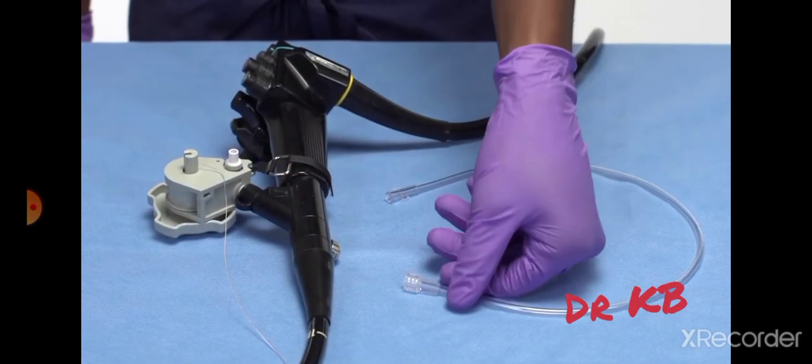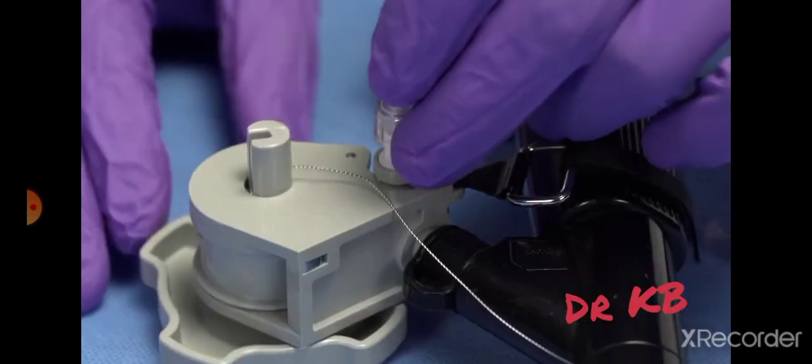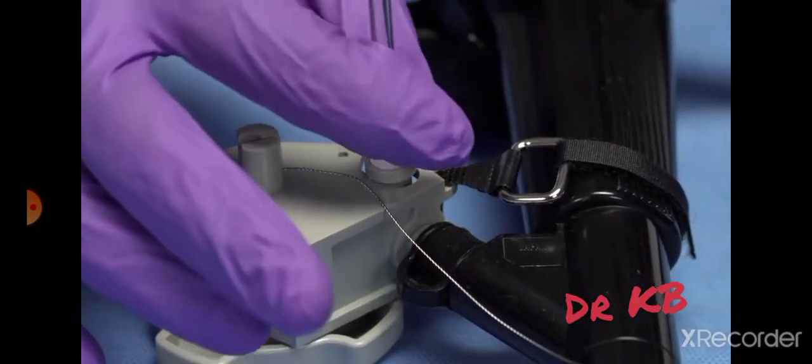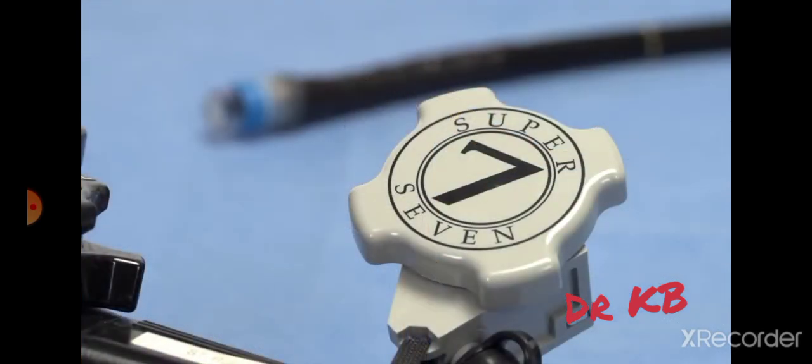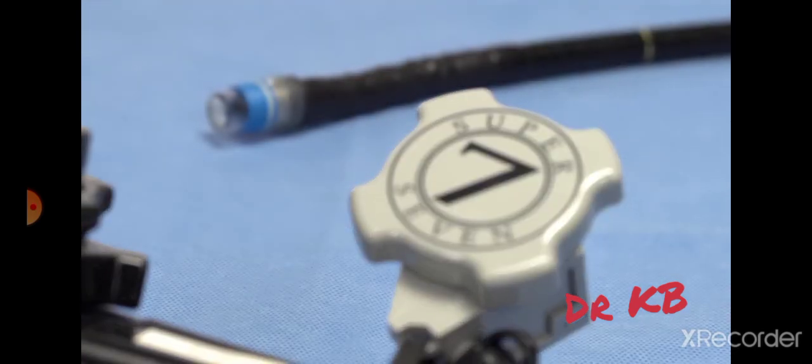For irrigation, attach a syringe or the irrigation tube provided to the luer fitting on the irrigation valve. The Speedband SuperView Super 7 device is now ready for use.